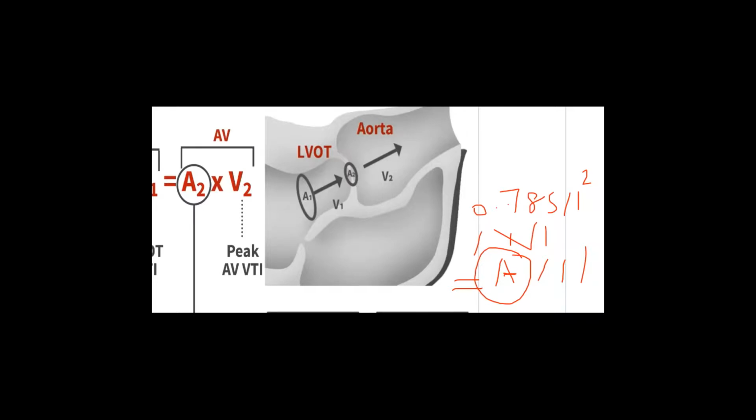Good? Good. Okay. So now you know the continuity equation. This is number 3.